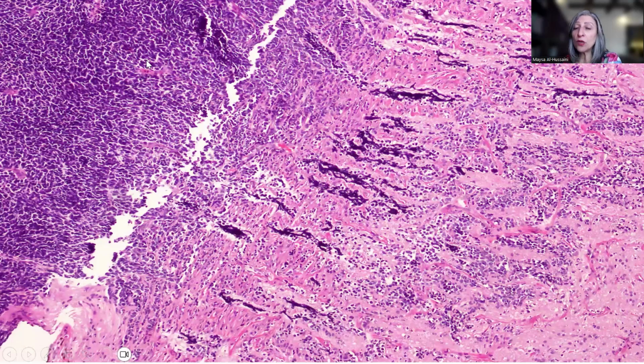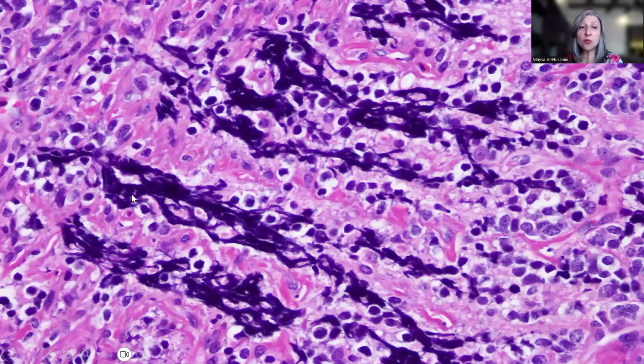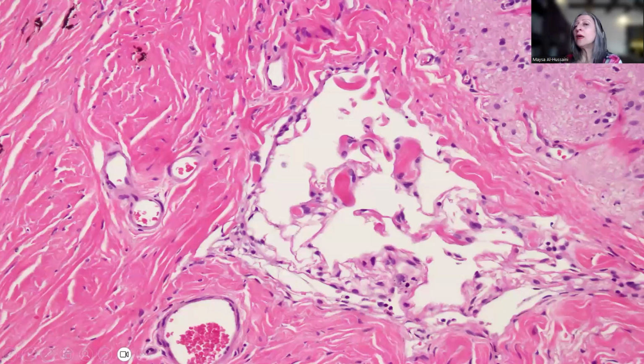And this is again on high power magnification, where we have here the basophilic structures. This is a smudging of the tumor cell nuclei, and this is the intact tumor cells infiltrating the optic nerve. Again, on higher power magnification, this is the smudged area of the chromatin, and these are the intact retinoblastoma cells.